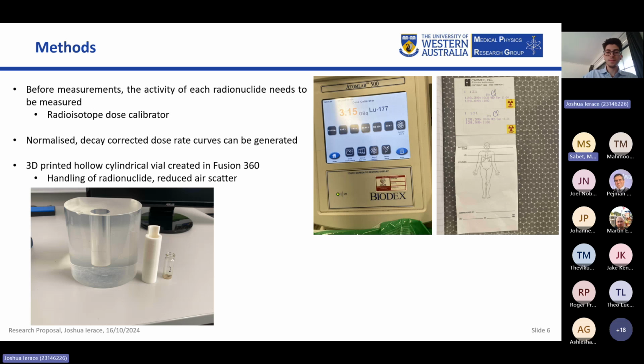So how does that activity affect your uncertainty of measurement? I'm not entirely sure. For the errors, I'll just be using absolute errors from the Fluke device itself. I've got documents that say its calibrated error, so I'll just be using that. I'm not entirely sure how the activity will play into that. Okay. I would expect higher activities would have less error. Yes, so it may be something to think about.